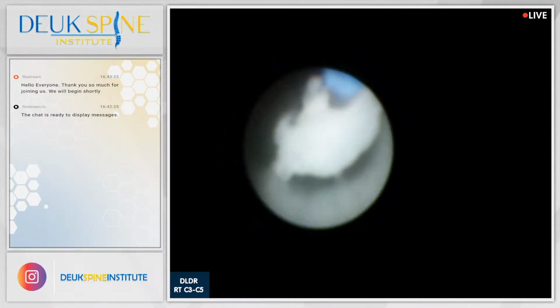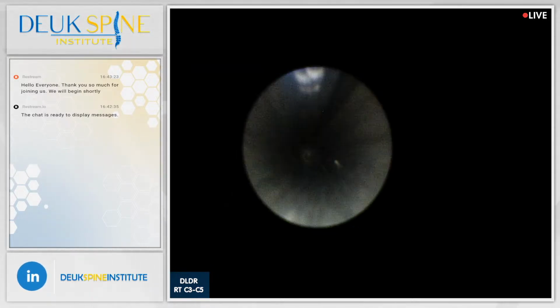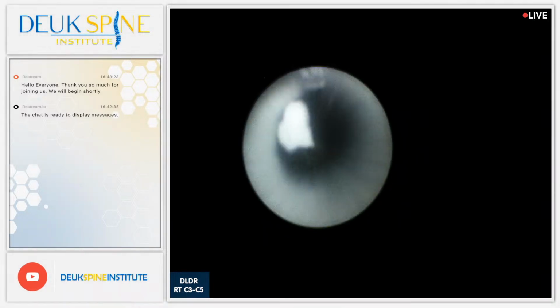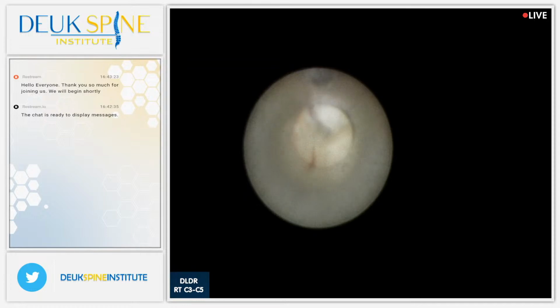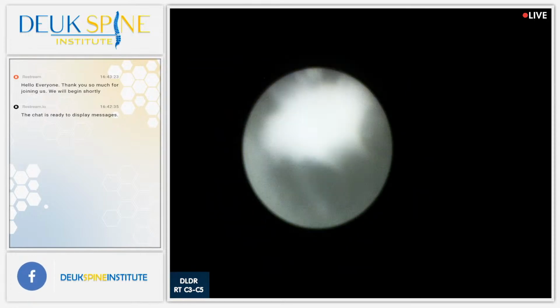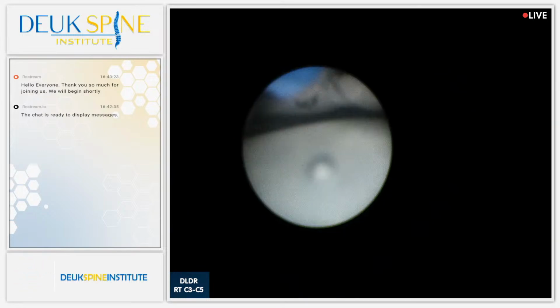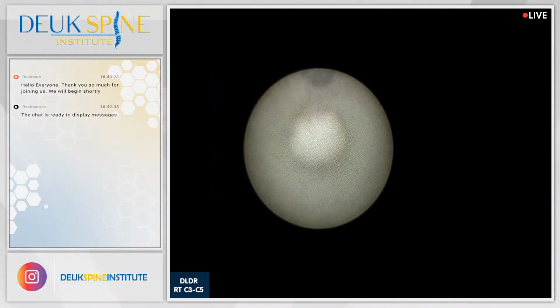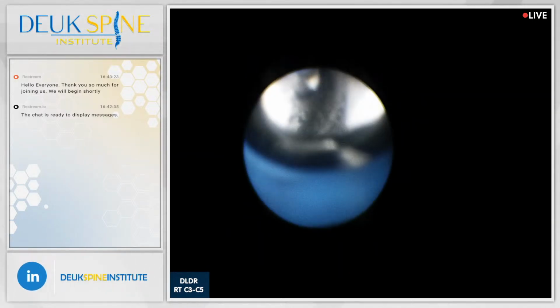See it? I just cut a piece. It was a bigger piece. I cut it in half, and now I'm floating out one piece, and I'll float out the other. But they really don't have anywhere to go except up the tube, right? They're stuck in the back of the disc, and they're pushing on his spinal cord, pushing on his nerves, and I'm giving them a place to go, a way out, basically. They're under pressure because there's so many of them just crushing. That's a big piece. I'm going to have to take that out with the grabber.